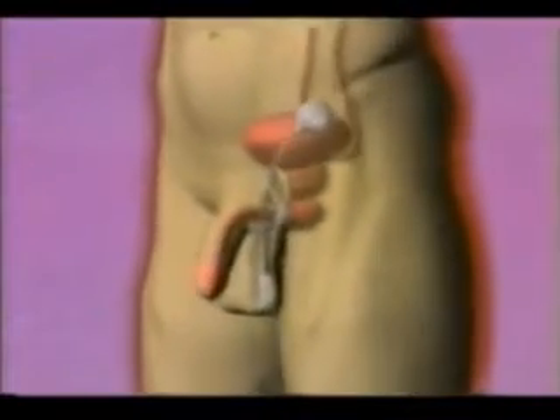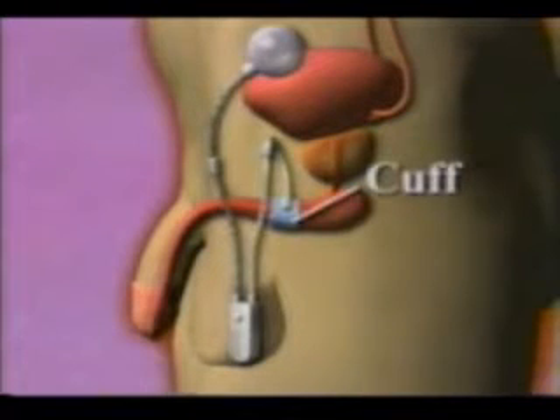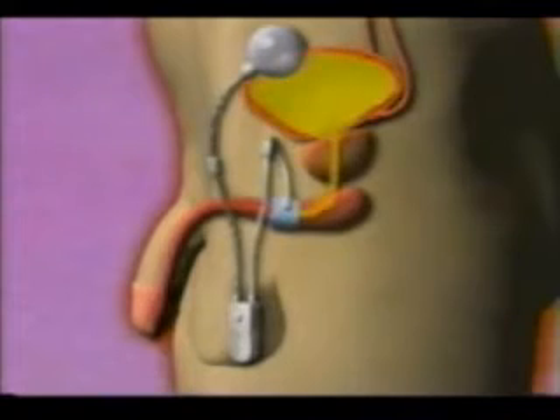The artificial urinary sphincter is implanted entirely within your body. The cuff is filled with fluid and gently squeezes the urethra closed to keep urine in the bladder.